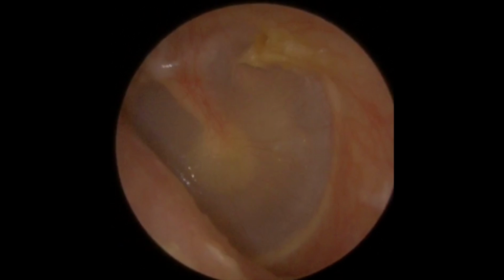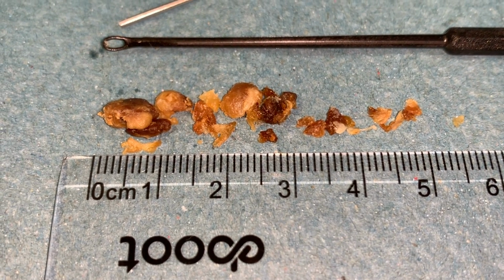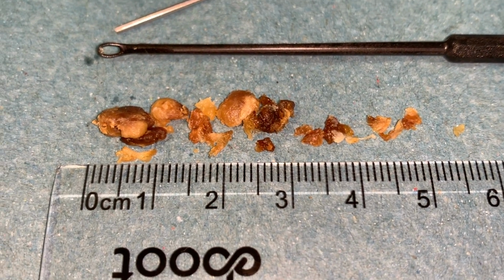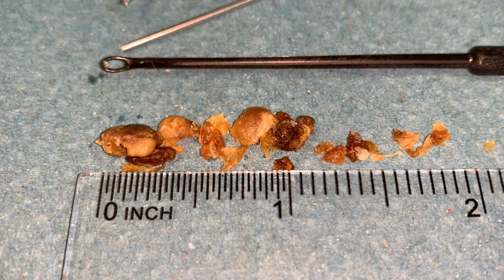So we can see the eardrum there. Now you can see there's a little bit left in the top right hand corner. I just couldn't get the angle to get up there. Unfortunately, it just wouldn't allow it. And rather than work that close with not much movement, I'd rather leave it. And this is what we removed.